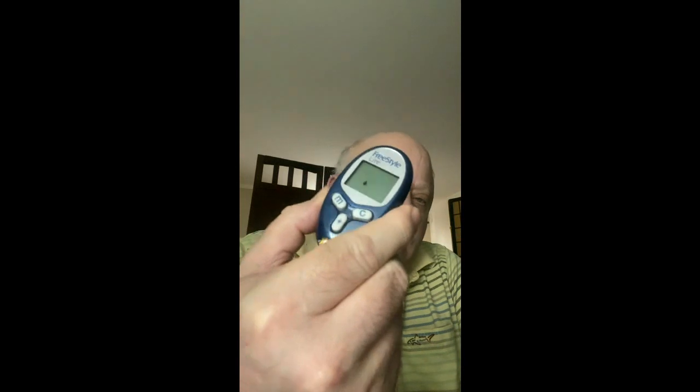This test strip goes into this meter — this is a Freestyle meter. You insert the strip into the meter, it turns on, and it says there's a drop of blood to put on there. So we take an alcohol pad, get our finger, and we draw blood.